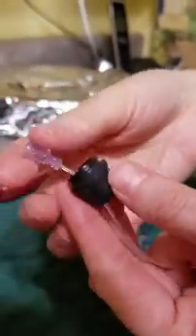So now, I'll take the new tubing, take the cap, and you just do that. Make sure this is facing so that it can be twisted back into the pump. If not, you just have to take it off and redo it. But you don't have to redo that unless you've already hooked it. So, we just stick that back in. And then you twist it back on.